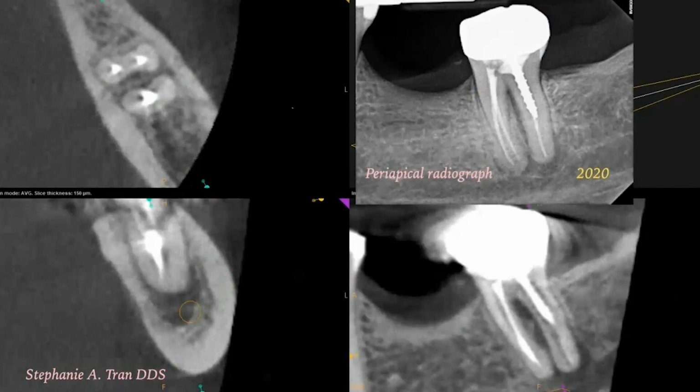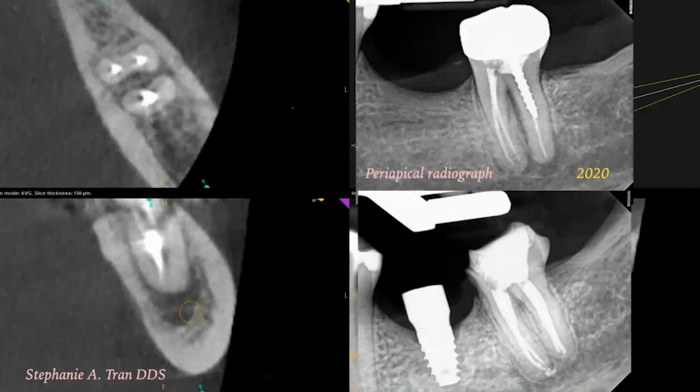So sometimes we do want to give the tooth a chance when there are no obvious issues with redoing the endodontic treatment or revising the previous endodontic treatment. So we can see here that this tooth healed.